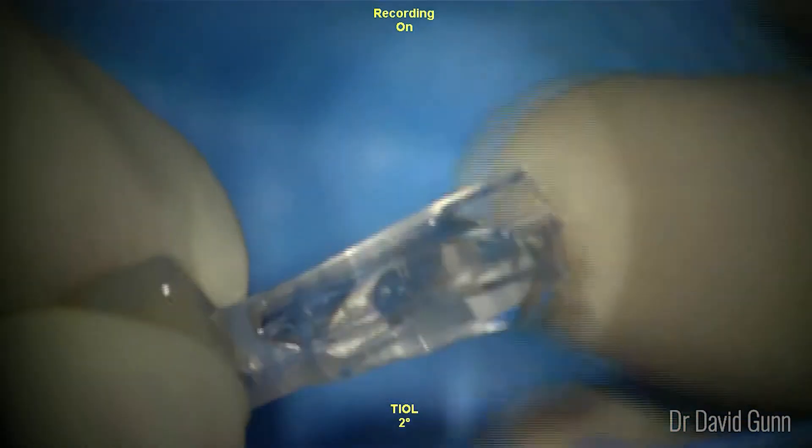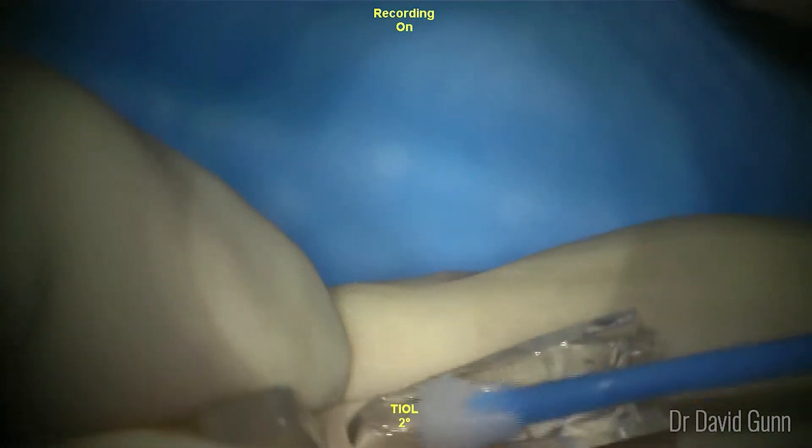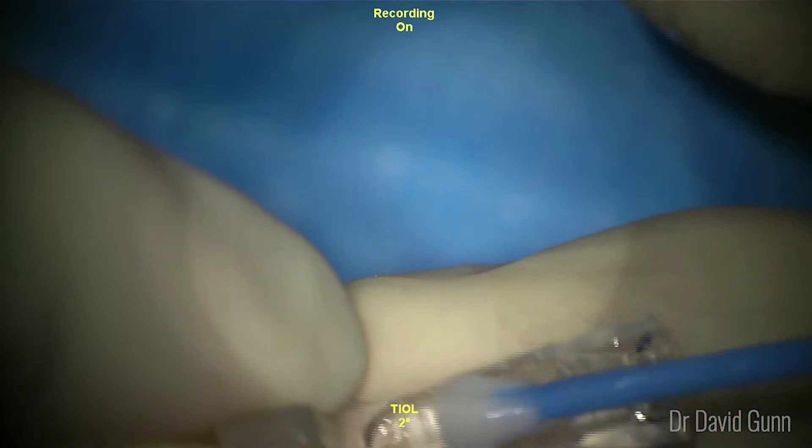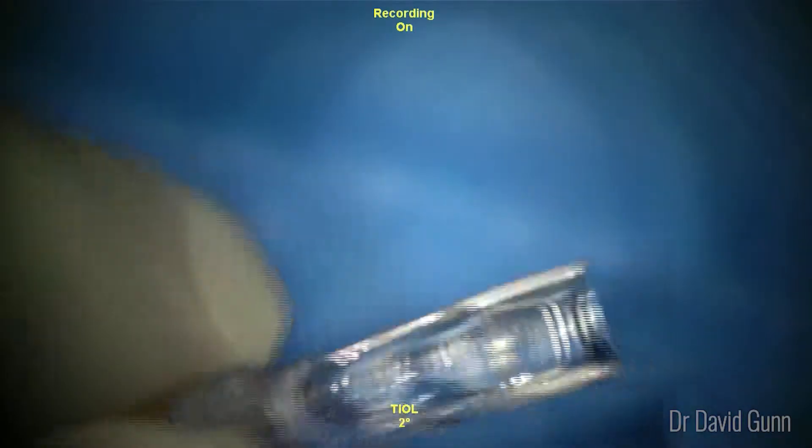Viscoelastic has been placed in the injector cartridge provided by STAAR, and very gently the ICL is rolled into position. You can use the circular dots to align the lens so that it's sitting centrally within the injector cartridge.